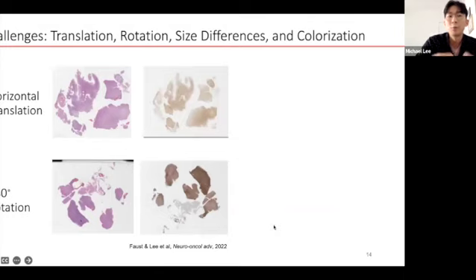The challenges still remain, though, especially if we wanted to unify the H&E stained analyses and the IHC quantification with respect to horizontal translation between the H&E stained whole slide image and the IHC, as well as 180-degree rotation. And so we wanted to see if there is a way we can align these two different images, tissue sections essentially, and be able to do a combined analysis on both of them.